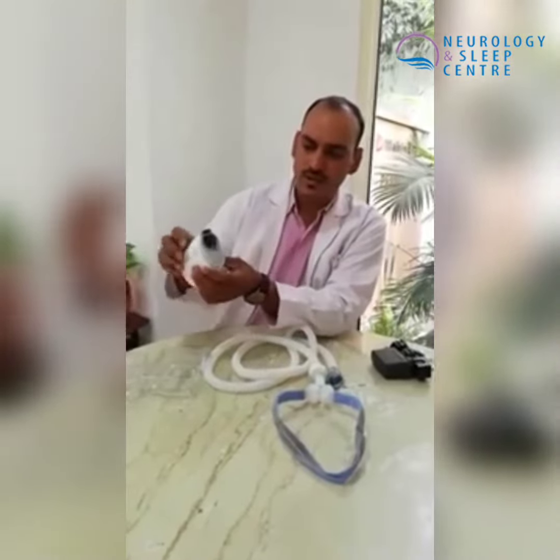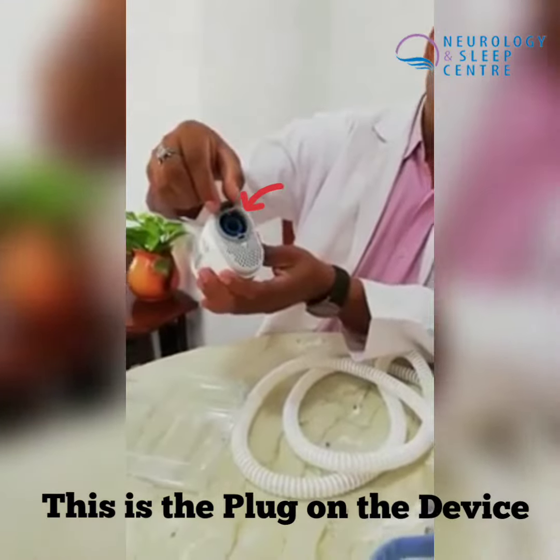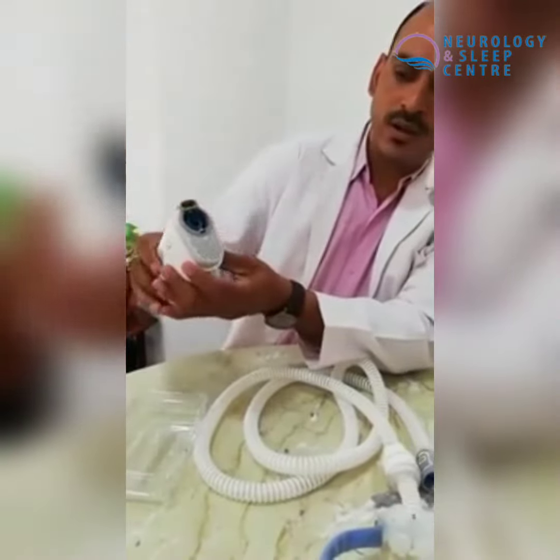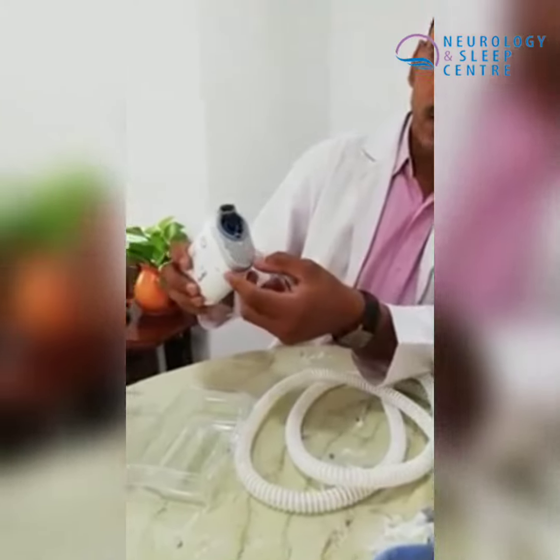First of all, this is the device. I want to tell you about it. This is the plug and adapter. This is the tube. Where the tube connects, this is the filter.